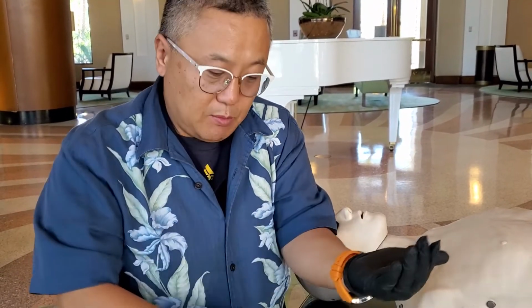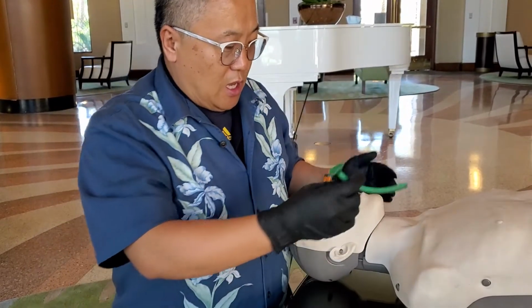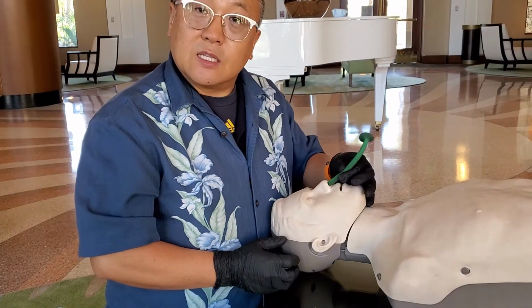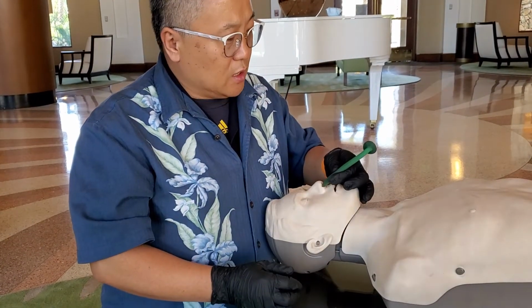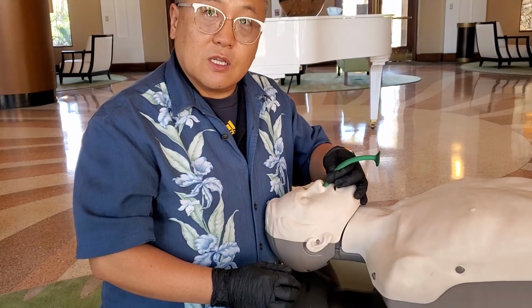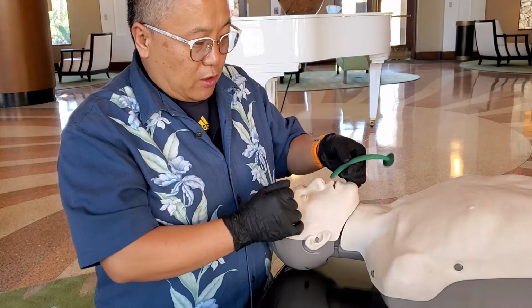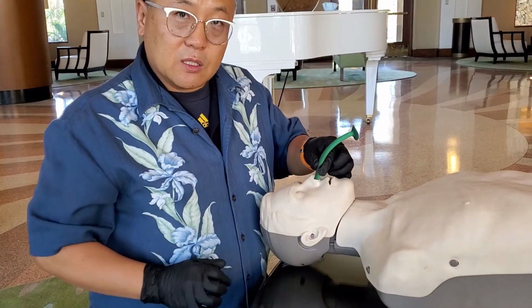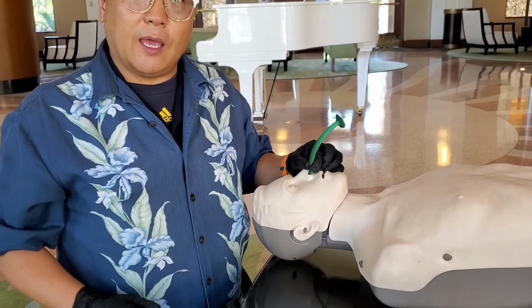Squeeze it on your palm, dip it a little bit like here, and then put it in the nose, like this. And then go inside. As you go in, you twist it and then push down. So right here, you put it in, lift a little bit like this, and then push down. Okay, that is an NPA.